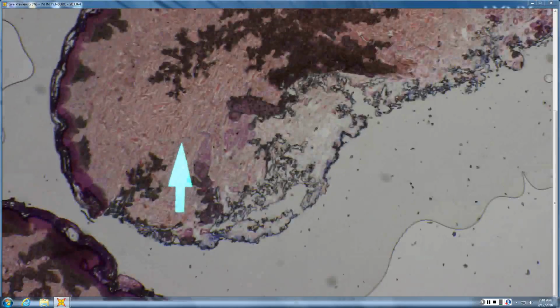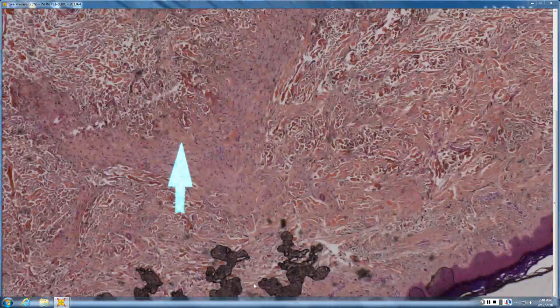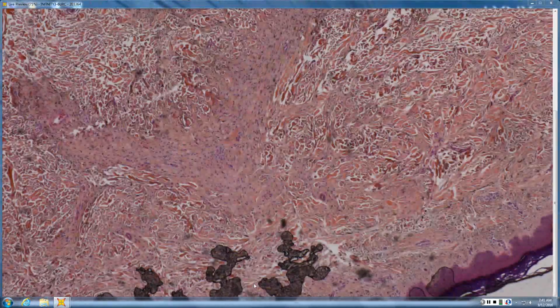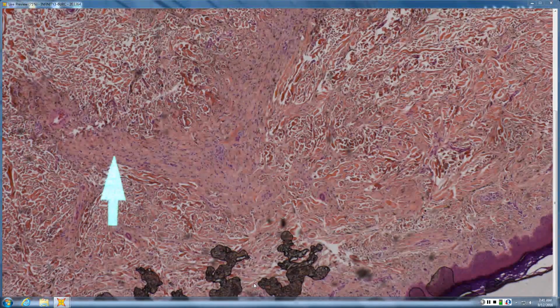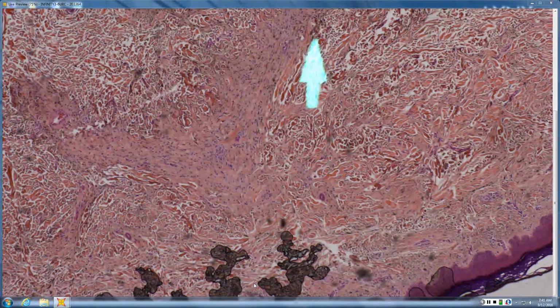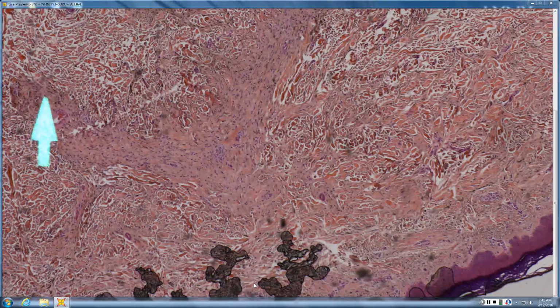Okay, well, we got a few air bubbles there, but let's look at center here. Tiffany, what do you see? Seeing some. There's definitely something in the dermis. It's spindly looking. So spindle, and does it break up into individual cells, or does it remain in big theques or nests at the base? It's remaining together. And are they parallel theque pattern, or is it one big branching thing?